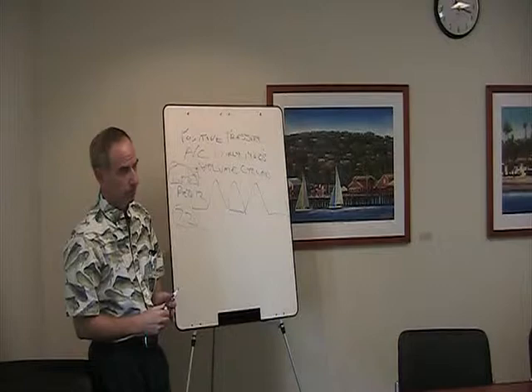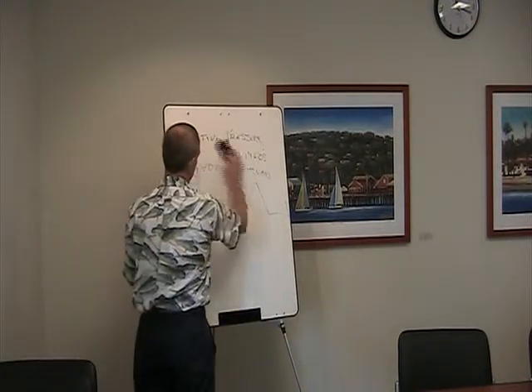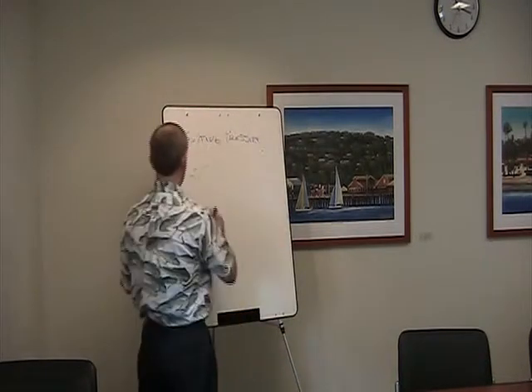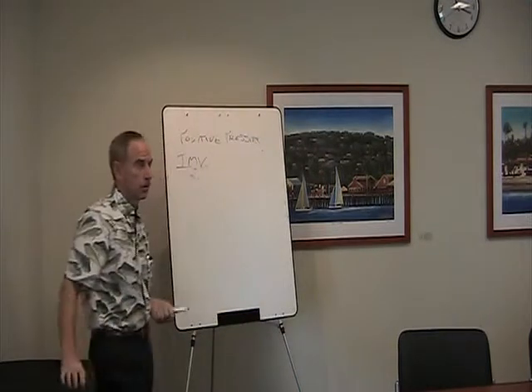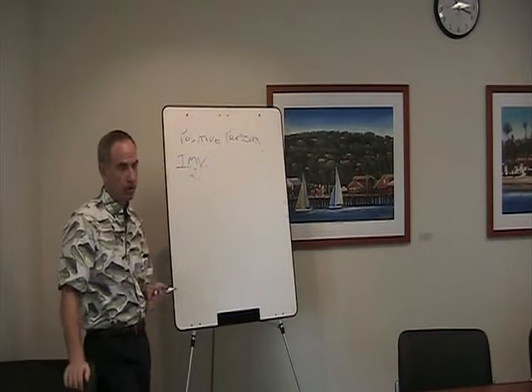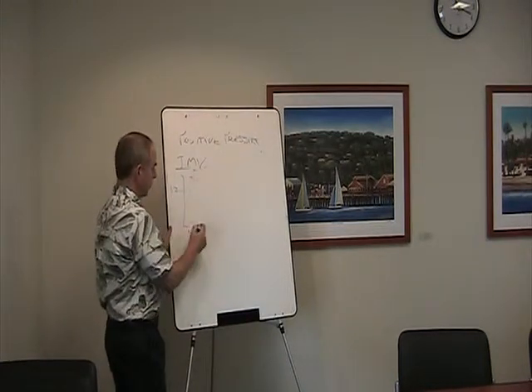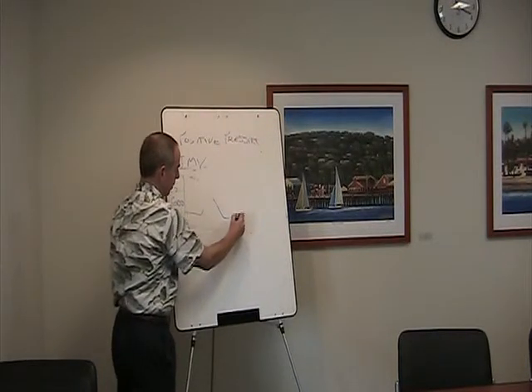What was that? Close, it was not SIMV, it was IMV. What does that stand for? Intermittent mandatory ventilation or intermittent mechanical ventilation. So what does that mean? If I set a rate of 12 and a volume of 600, what's going to happen in this mode of ventilation?